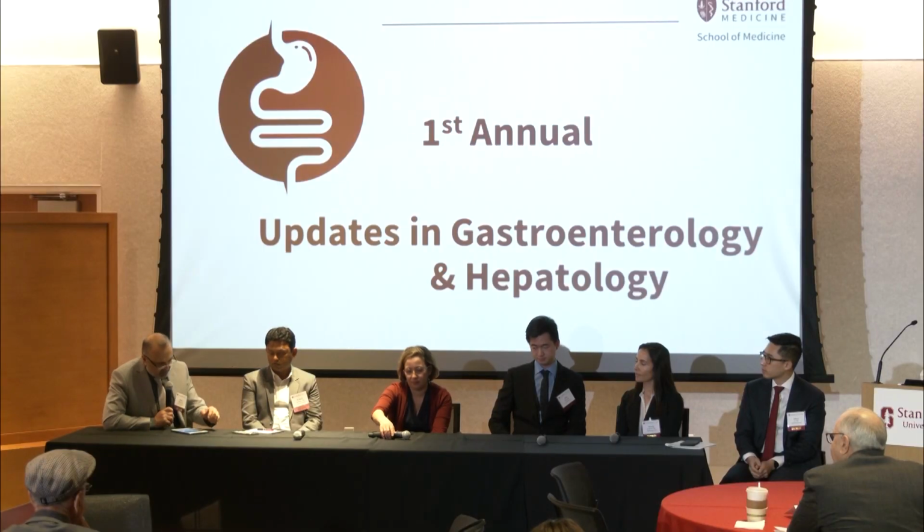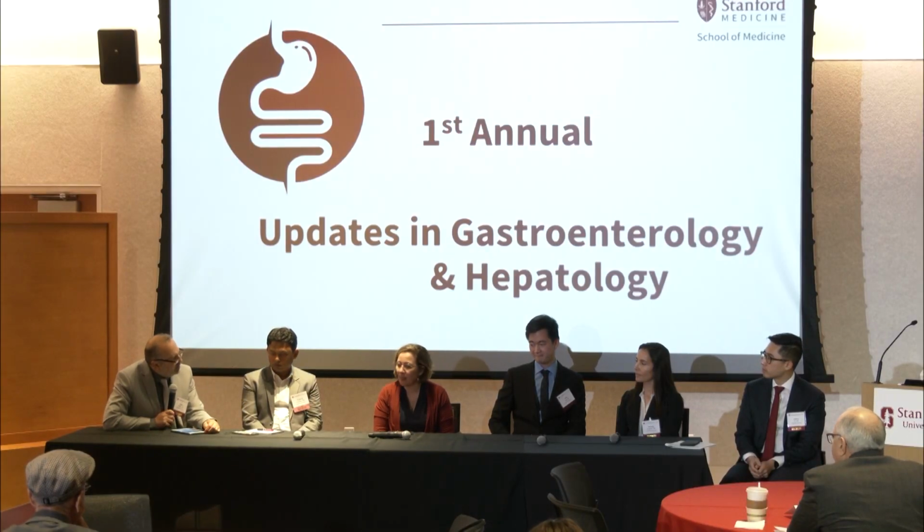Great, thank you. So what's your biopsy protocol? Like, what do you recommend? D2, bulb biopsies? So what's recommended is, it's a patchy disease, so you want to take multiple biopsies. And what's recommended is 4 biopsies in the distal duodenum and at least 2 in the bulb.